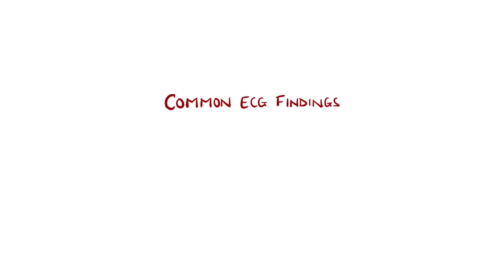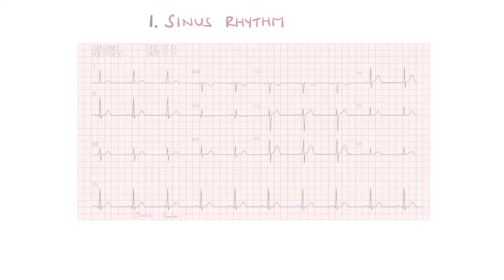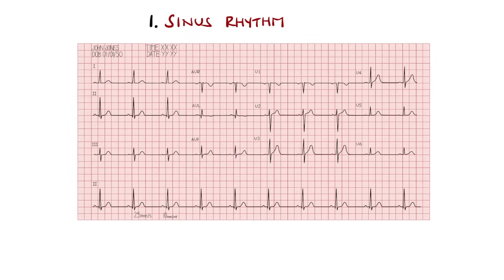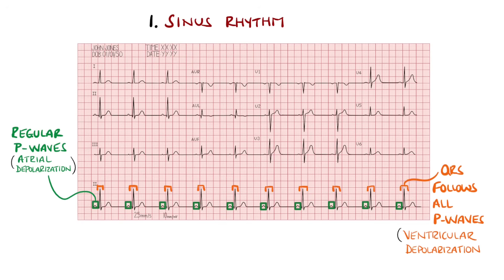In this video we will look at some of the most common and must-know ECG findings in medicine. We start with sinus rhythm, the normal rhythm of the heart. There are regular P waves followed by a QRS complex that represents normal conduction of the electrical signals from the sinoatrial node in the right atrium through the atrioventricular node and bundle of His into the ventricles.